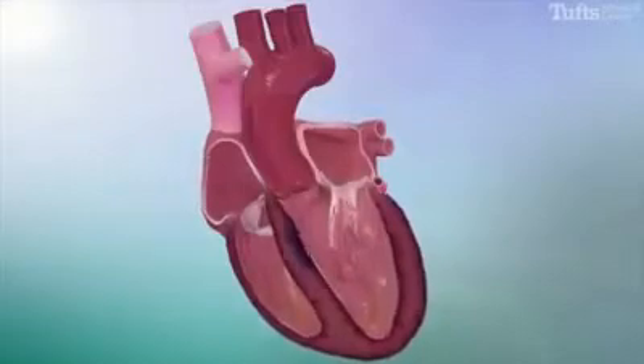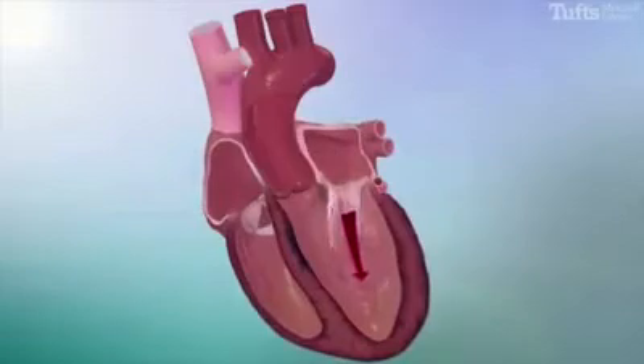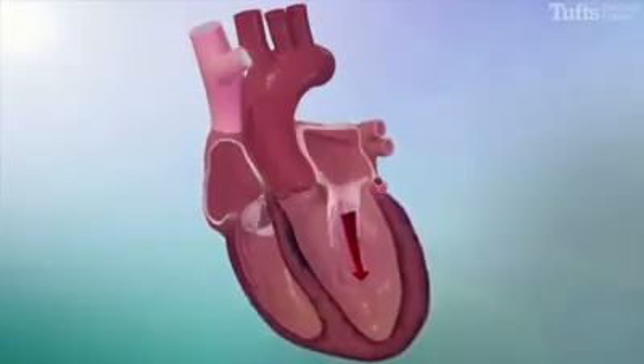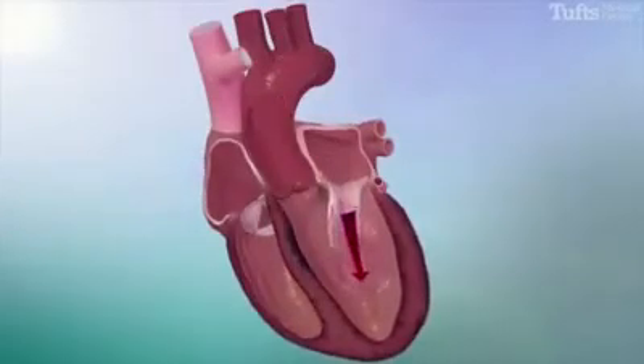By thinning this area, the mitral valve will not move toward the septum, eliminating obstruction to blood flow. This restores the pressures in the heart to normal, resulting in a significant improvement or elimination of heart failure symptoms.